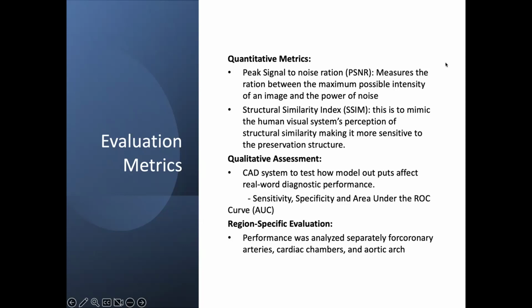instead of just asking a real person to look at it. For cardiovascular images, these evaluation metrics are critical because of the subtle anatomy detail, and by ensuring that noise reduction does not degrade the structure in the image, and also testing whether the denoised image actually improves the CAD system performance, we aim to provide a comprehensive and clinically relevant assessment of the model's utility in cardiovascular imaging.